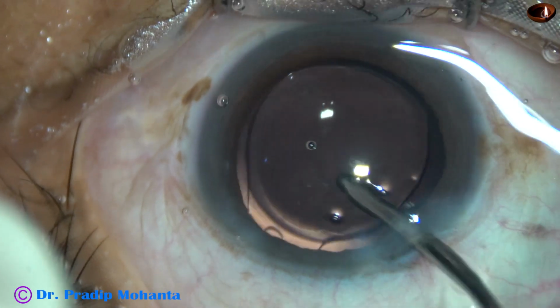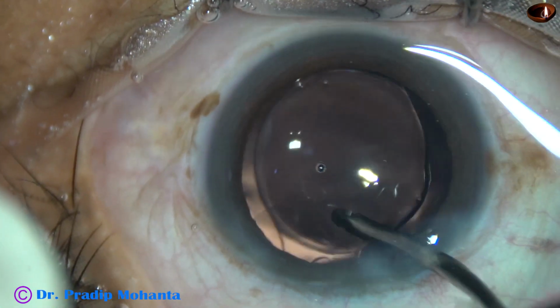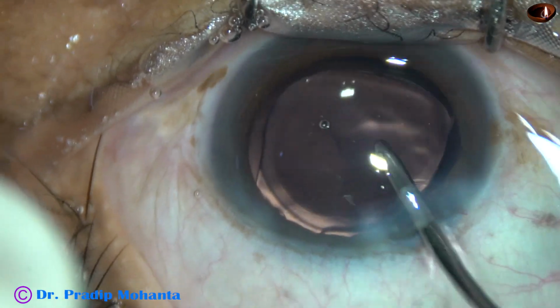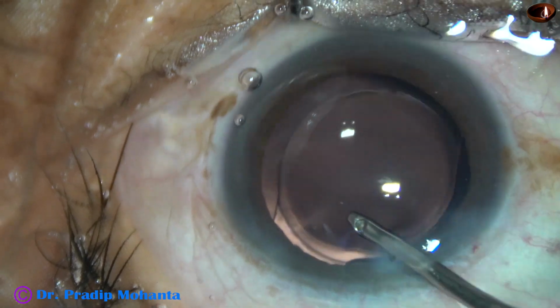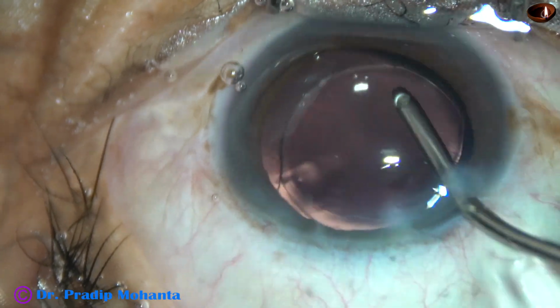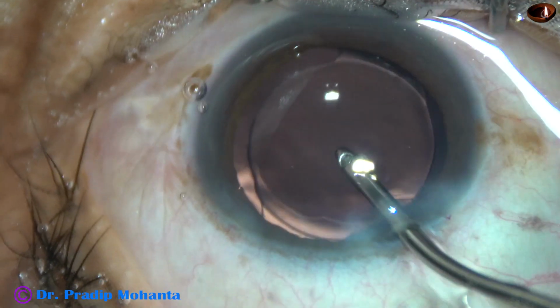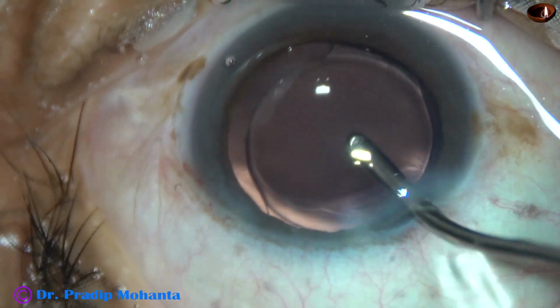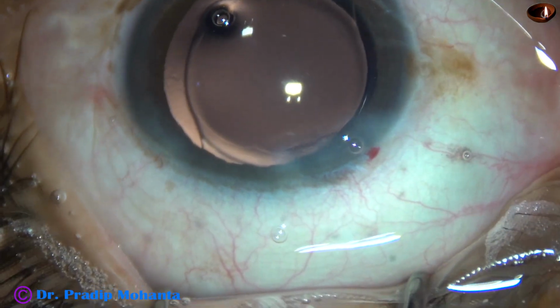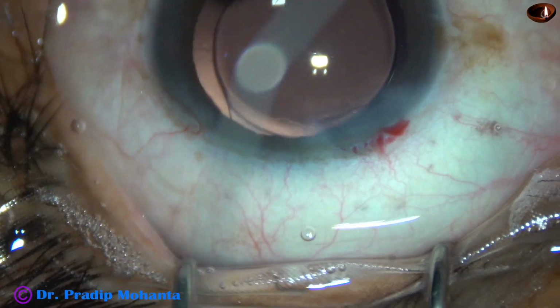Now the lens is dialed. The capsular bag is also irrigated. The anterior chamber is also irrigated, and now we are towards the end of the surgery. This is a real-time surgery, and you are watching each and every step of the surgery.